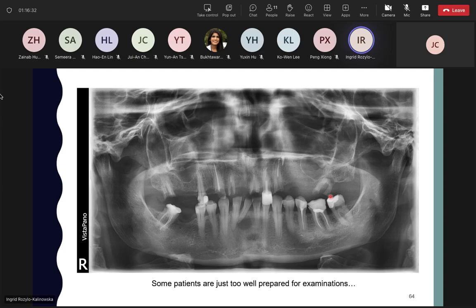But the patient claimed that her fixed bridge was removable, and she just took it out. So what you can see here is just the places for the posts for the denture. Absolutely amazing that the patient did not have any periapical lesions with the constant contact between the oral cavity and the places for the posts in the bridge, the fixed denture.